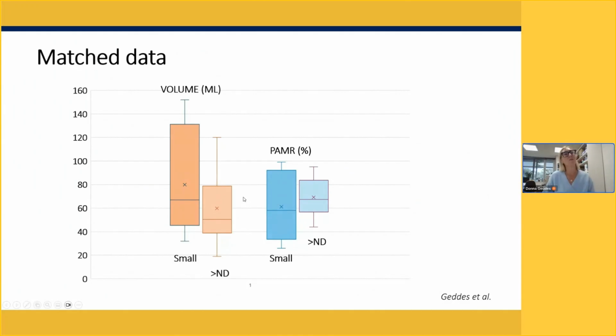So these are all things we need to consider, how we're measuring, what we're looking at. So really focusing on how the mum feels, what does it look like when you're fitting shields, should really be looking to see what's happening to the areola and the portion of the breast that may be entering the shield or not entering the shield for that matter.